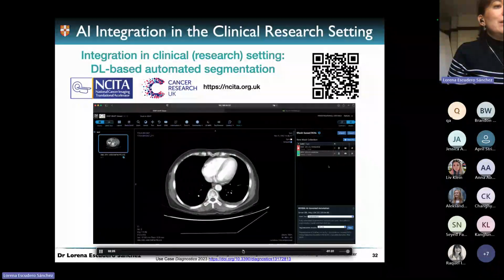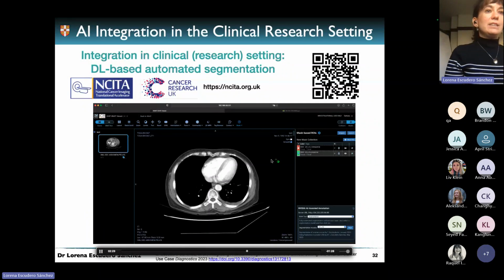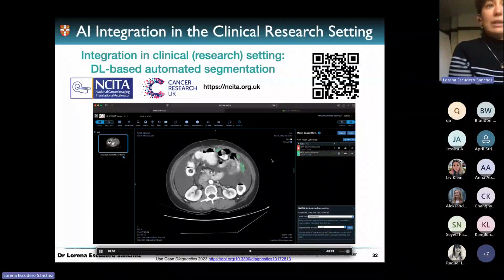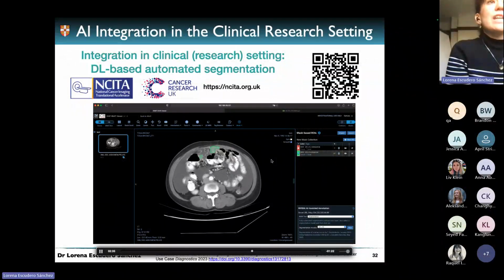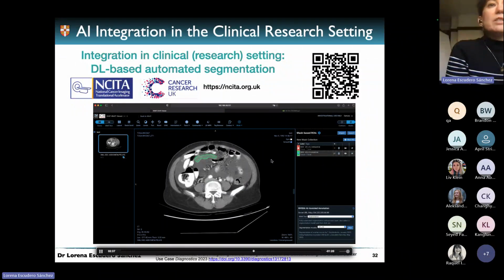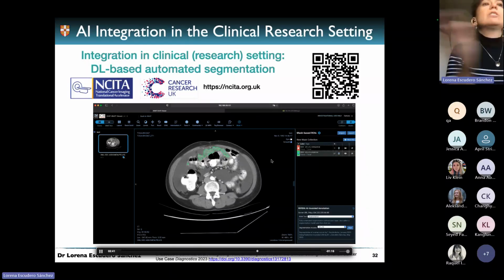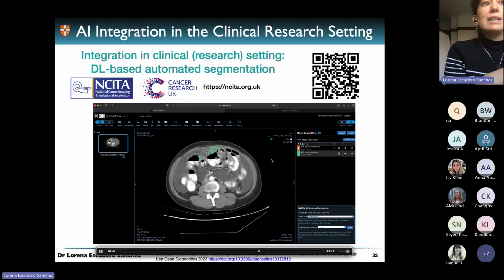But here I'm showing how we calculate the features and run the machine learning. And at the end, they get the answer that they want, which is which places the algorithm has found are tumors, and they are colored in green in this case because, after the segmentation, radiomic features and machine learning prediction, it finds that they are predicted to respond.